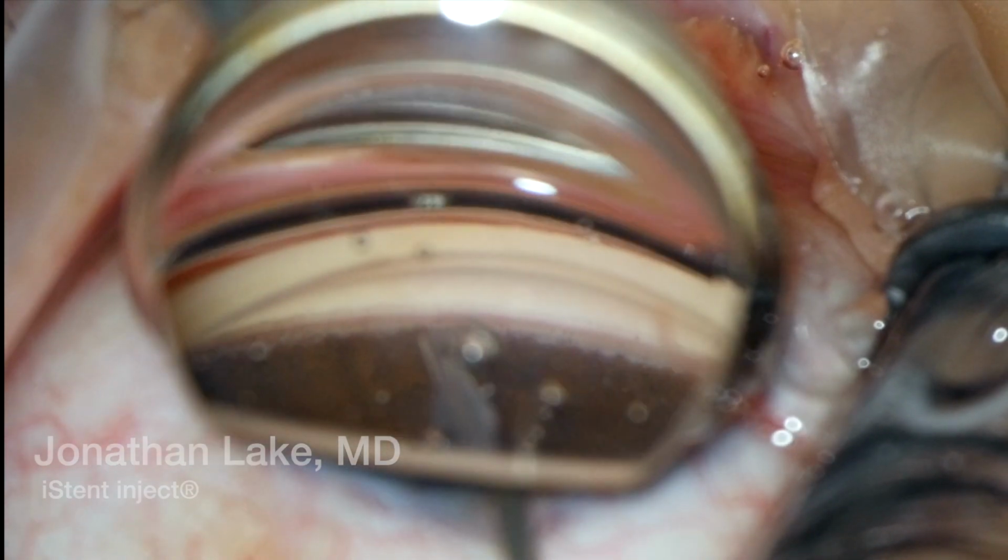Welcome everybody. This is a great case of an iStent inject after cataract surgery. So I'll show you a case of an underimplant that happened.